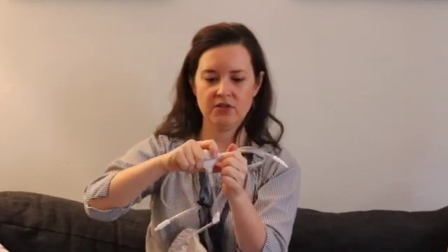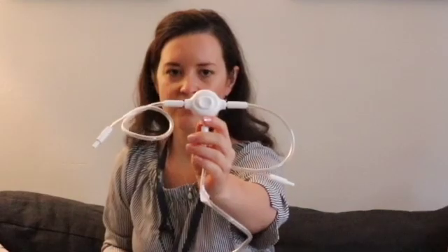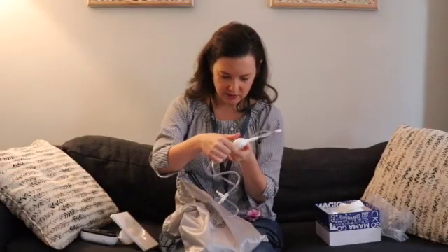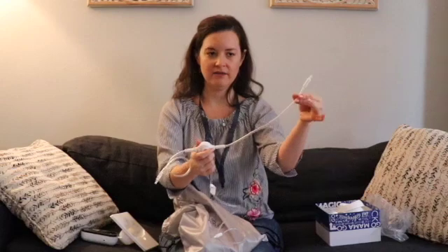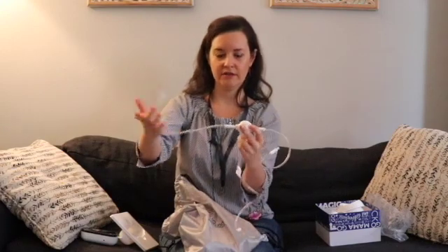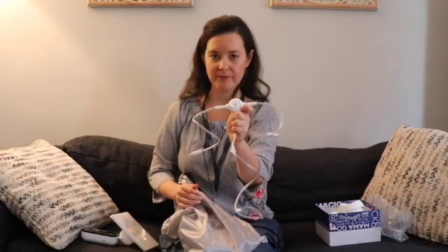And I'm gonna show you. This actually has a switch on the back of it. It allows you to, if you push it this way, pump one-sided on this side. If you put it in the middle, you can pump from both sides. And if you push it over to the other side, it will pump from just this side. So that's a really interesting function that's different from a lot of the other pumps that I've seen.